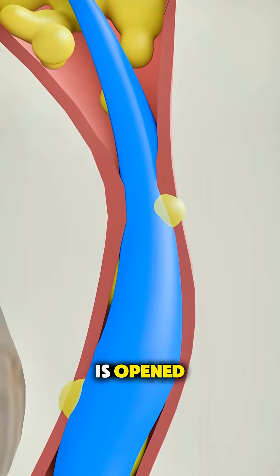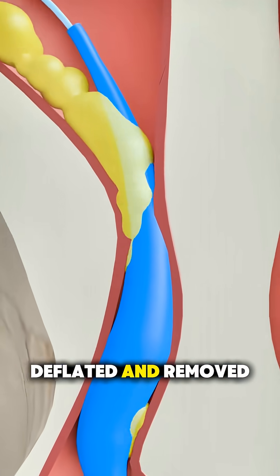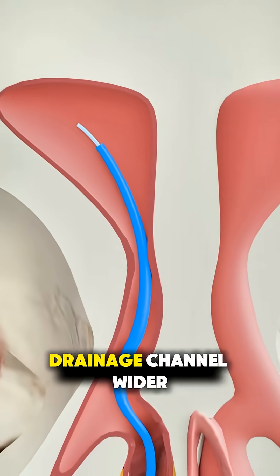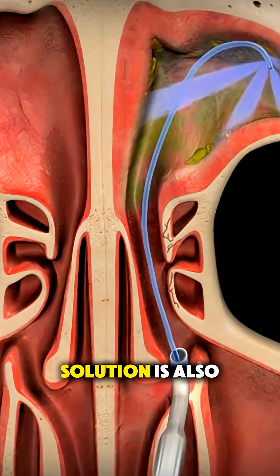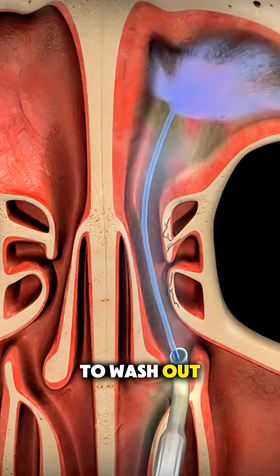After the pathway is opened, the balloon is deflated and removed, leaving the sinus drainage channel wider and clearer. Sometimes a saline solution is also flushed through to wash out mucus and debris.